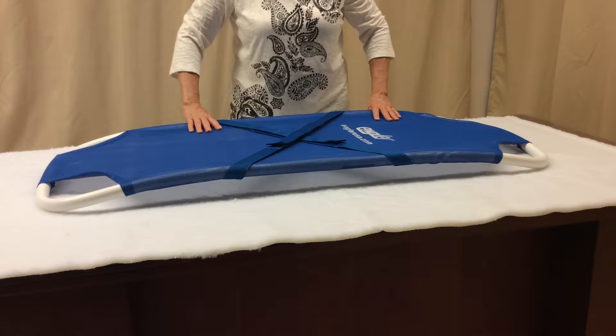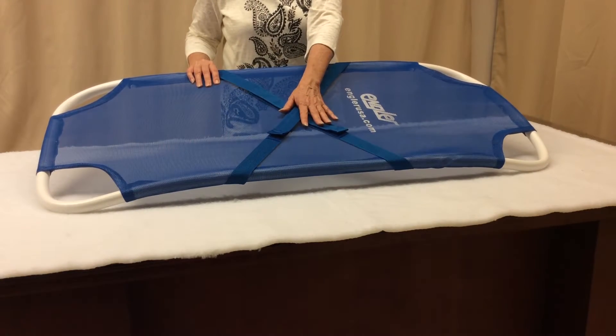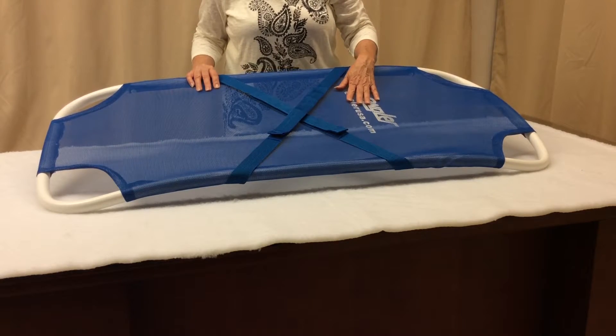Because it is also radiolucent, you can easily x-ray your patient while on the stretcher and you can even perform surgeries and dentals.